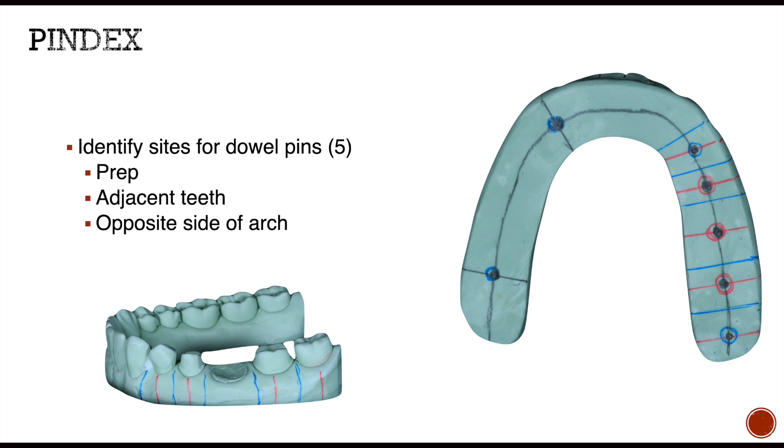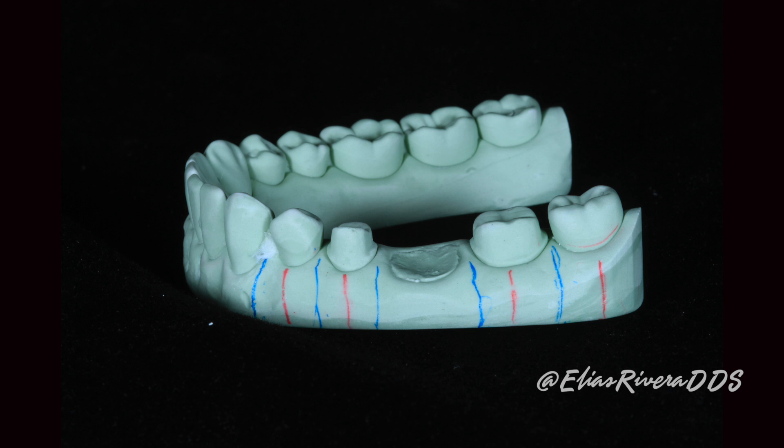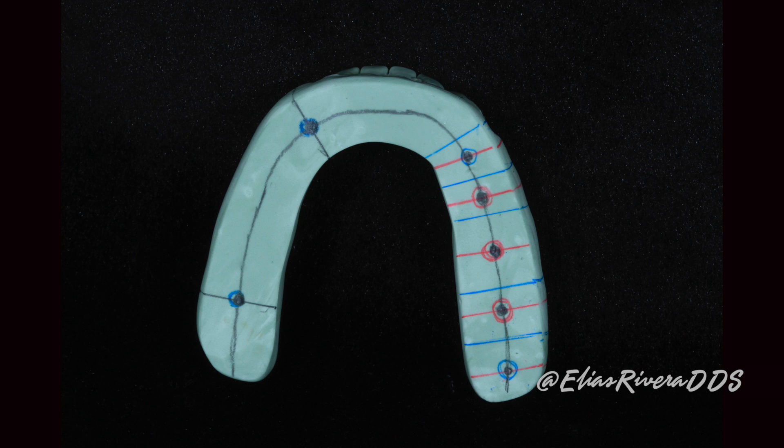Now is the time to start identifying the sites to place our dowel pins. For this, we're going to place reference lines. The red color reference lines are placed on the main abutments and the two neighboring teeth. Then, we're going to place blue color reference lines on the interproximal areas. These blue lines are going to be the reference for doing our sawing. These reference lines should continue onto the base. The color code makes it easy to identify the areas where we're going to be placing our dowel pins. In addition, we're going to identify two areas on the other side of the arch — teeth 27 and 31 — which will provide stability for the base.